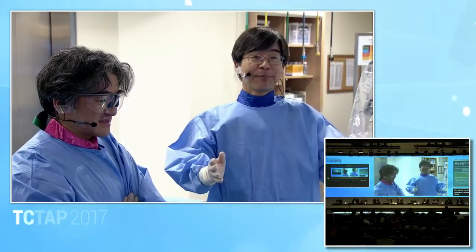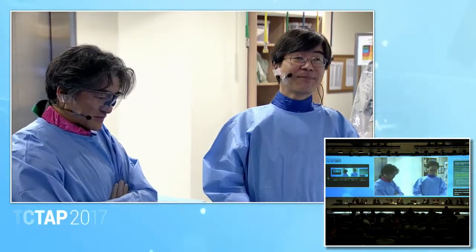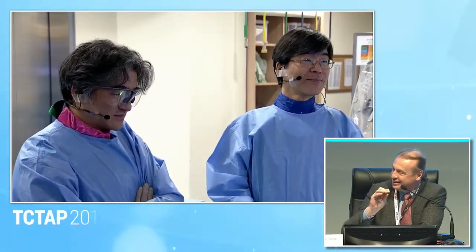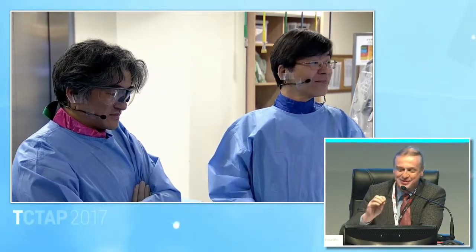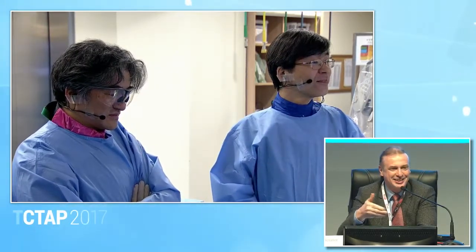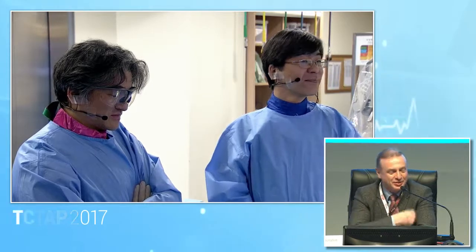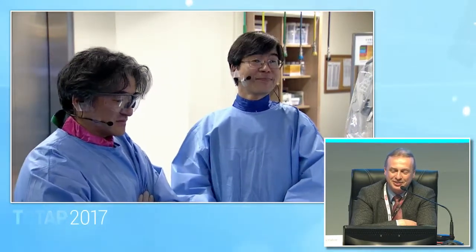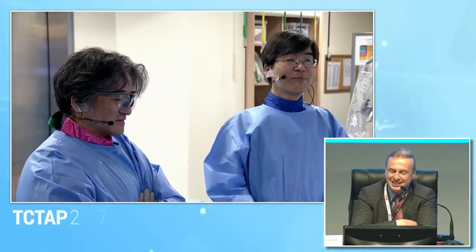How interesting discussion. We see your intended strategy would be to use IVUS and FFR, and maybe you can explain, and we have here great experts, why you think about IVUS and why you think about FFR for this patient?